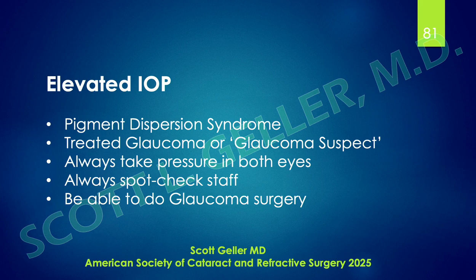And of course, the staff had been measuring it wrong with the Tono-Pen. I don't think they were doing both eyes. Maybe they were doing both eyes at the time. I forget off the top of my head, but it was wrong. They were measuring it wrong. The doctor was assuming that the staff was doing it correctly. He didn't ask the right questions of the patient. And basically, the patient was blind, and it came to a legal suit for the unfortunate patient. This could have been totally avoided by understanding what you're doing and the risks.